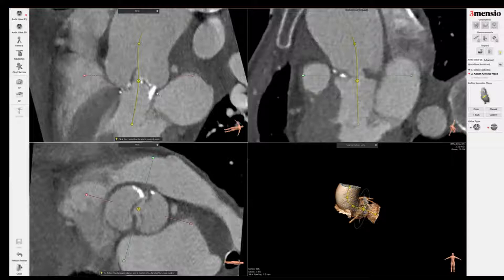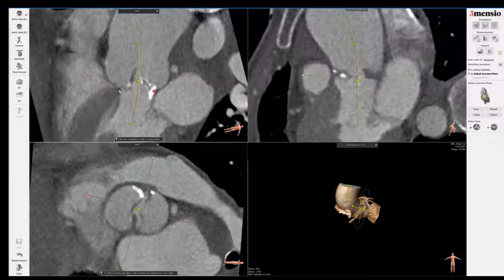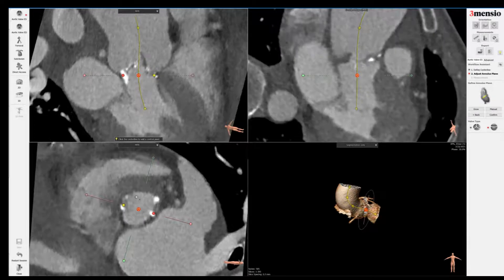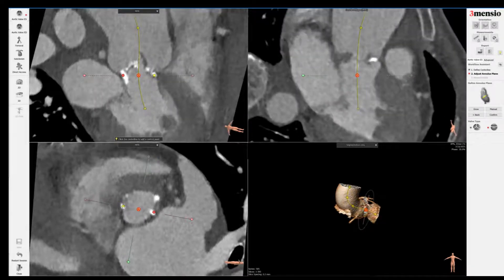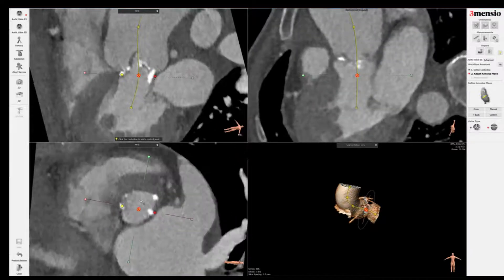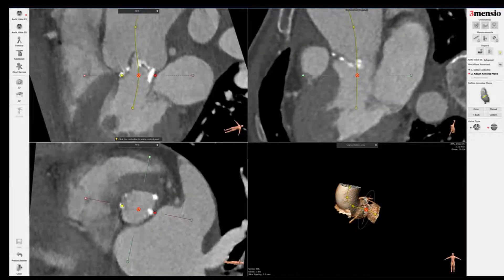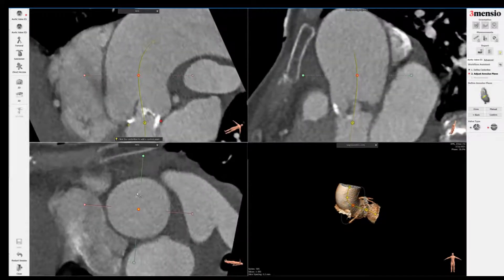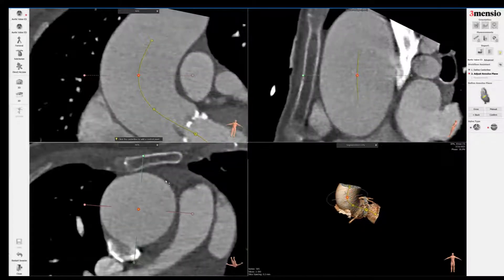I bisect the sinuses and then place a dot at the base. You don't need to rotate the open red circle because you can just go to 180 degrees on the opposite side and place a dot there. Then you just have to fine-tune the dot at the base of the sinus as shown here. Now I do the red dot the same way, then make sure your center line is preserved.